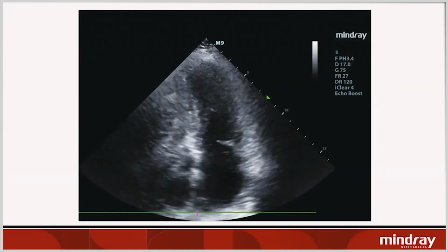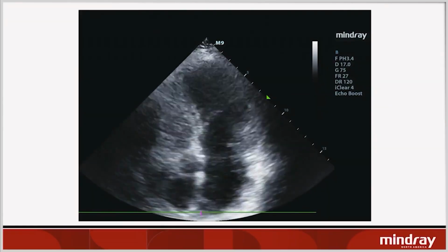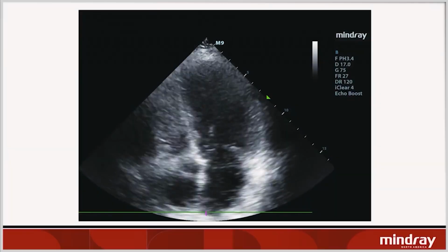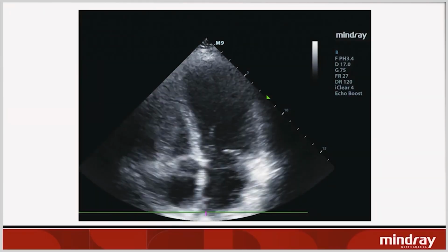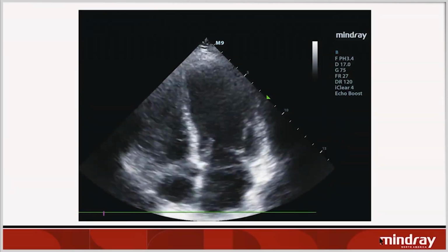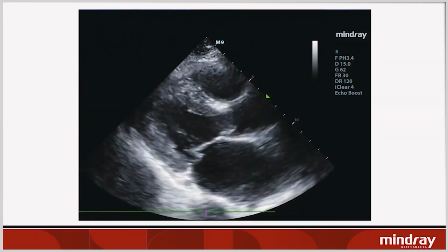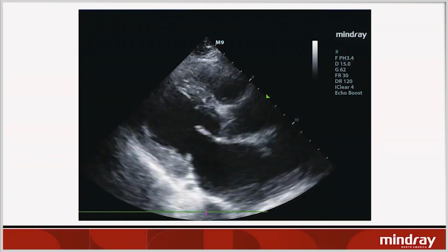And so what you're seeing there is the lateral mitral leaflet, which is the posterior leaflet, to the right on this image, is actually prolapsing backward a little bit. It's hard to tell on this image, but if you zoom in on it a little bit, here's another view. It's the leaflet on the bottom. You can see it's kind of sliding under the other leaflet.